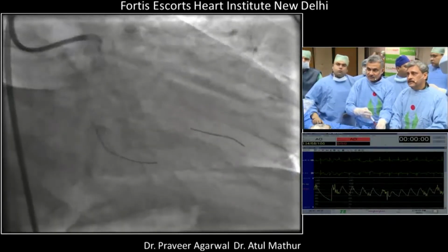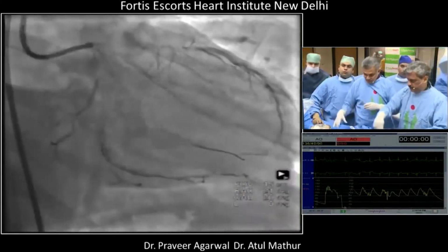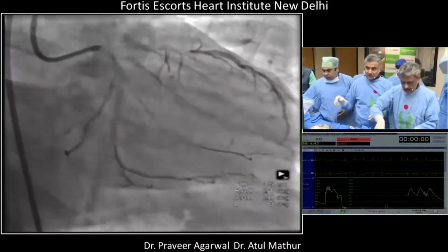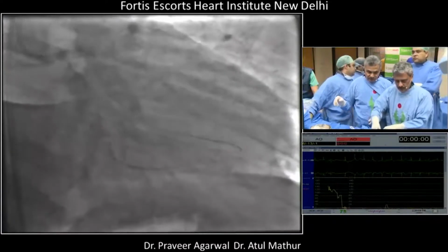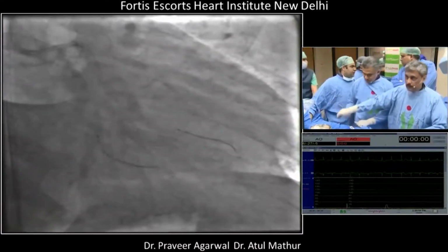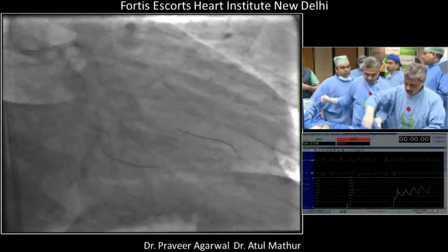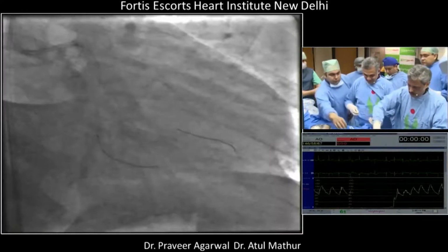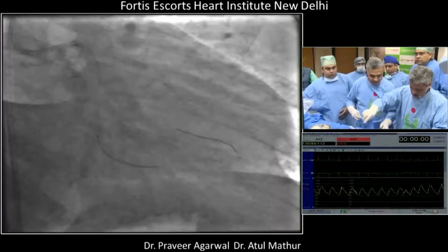Okay, so this is... Okay, we are not badly dissected. Can you advance? This again goes into the... Let's see the wire. So we also do cutting balloon? We'll do a simple plain 2.5 balloon, as described earlier. Once the balloon is up, it's unwrapped, and we try to advance the balloon again. If it goes in, then the cutting balloon probably will go. This is an NC balloon, right? Okay, yes, it's an NC balloon.